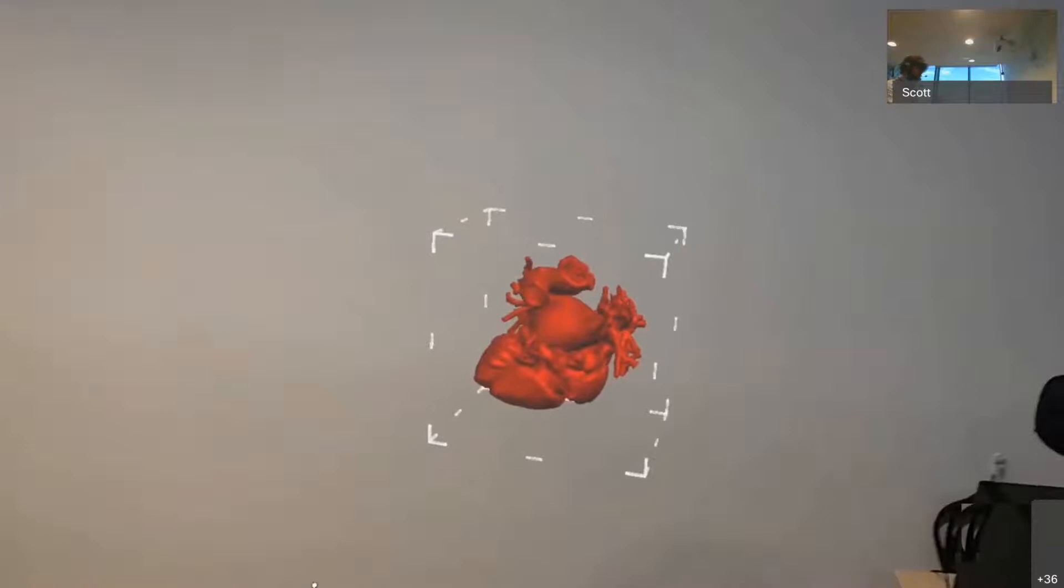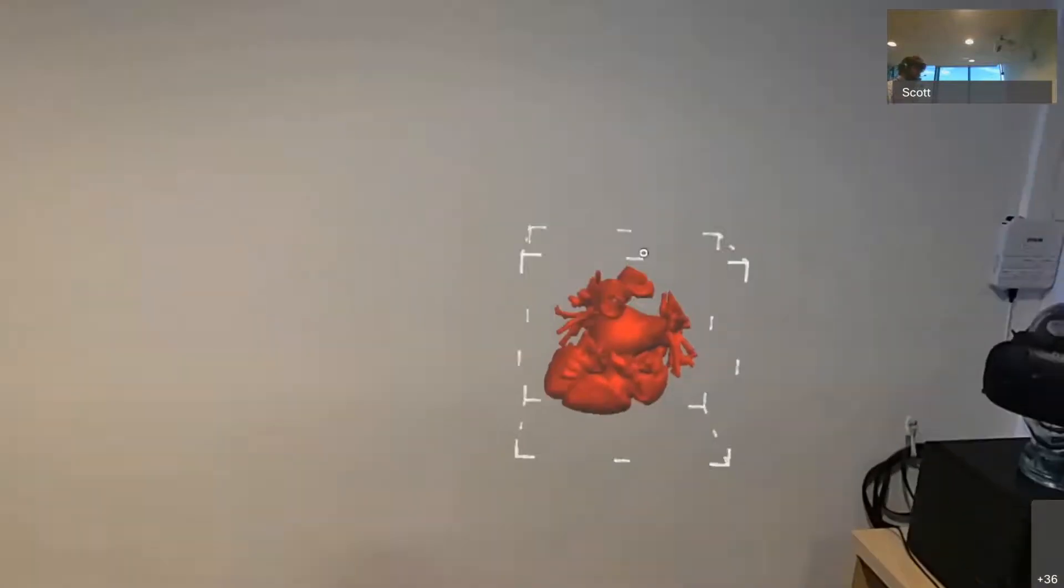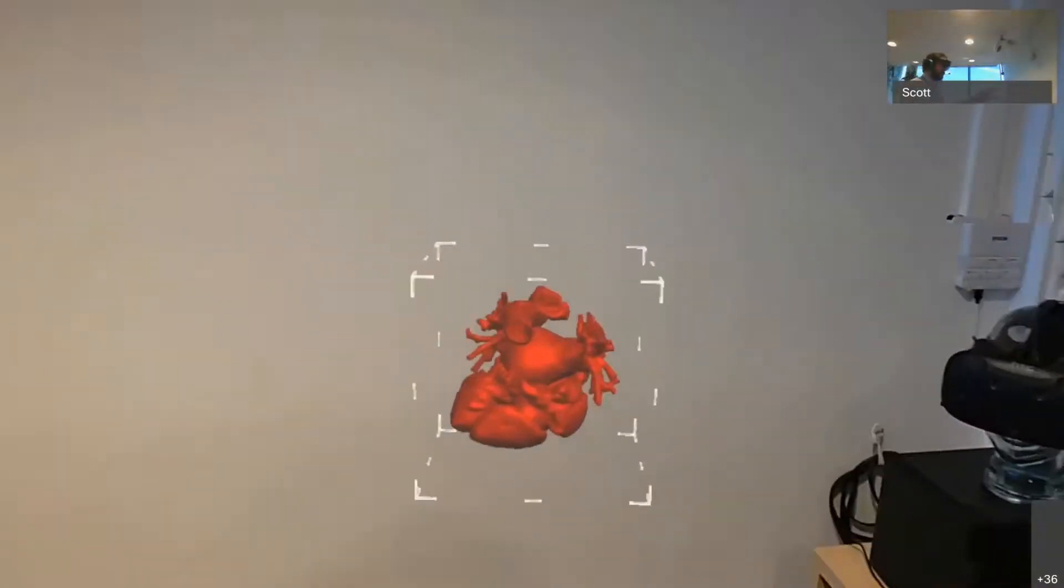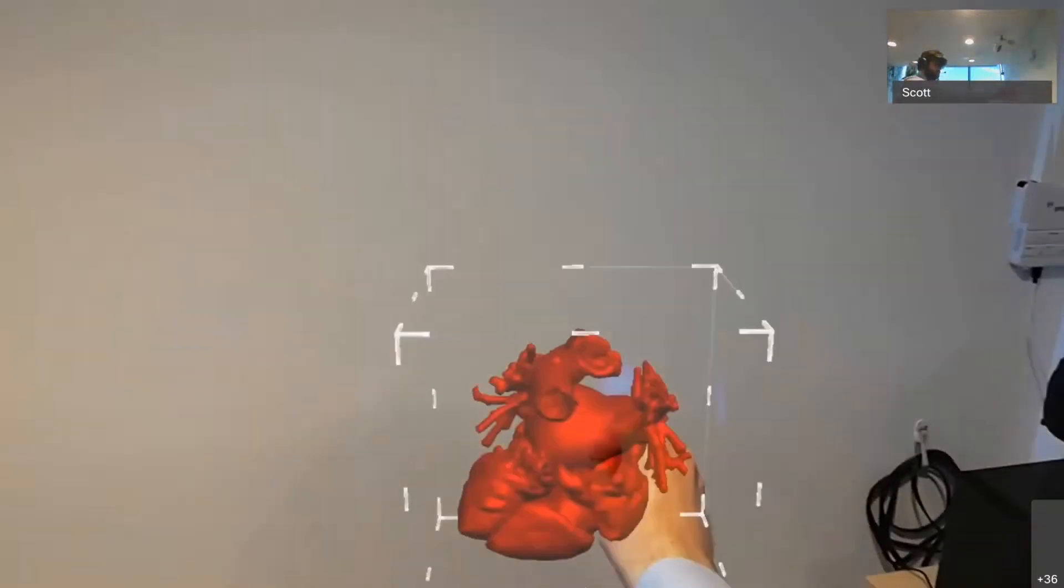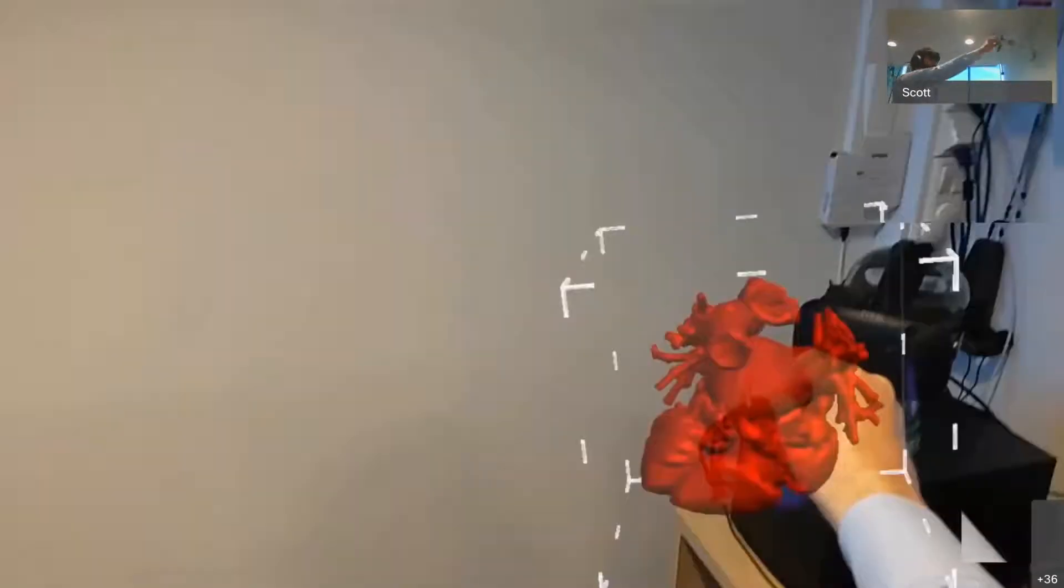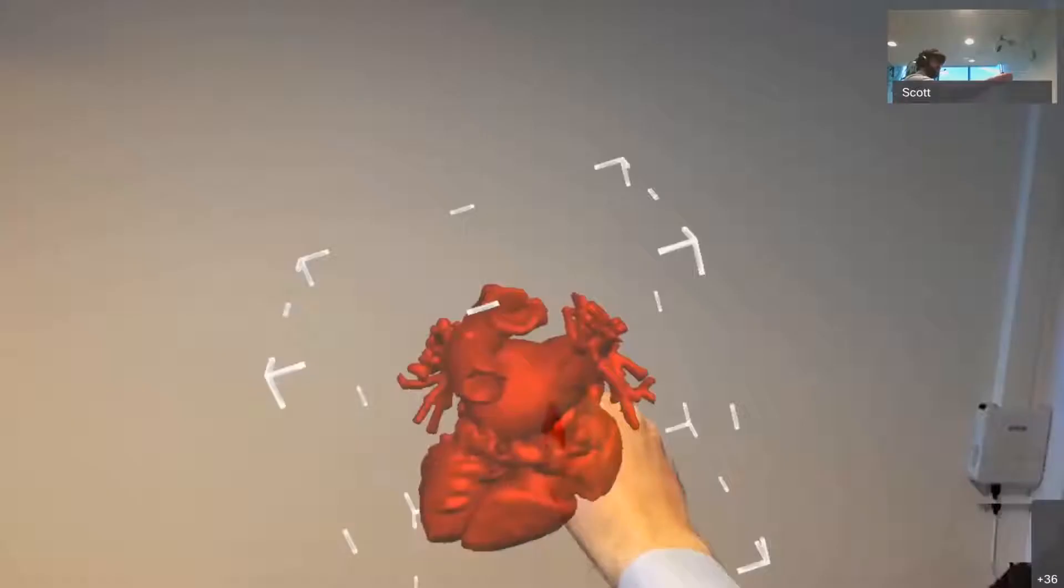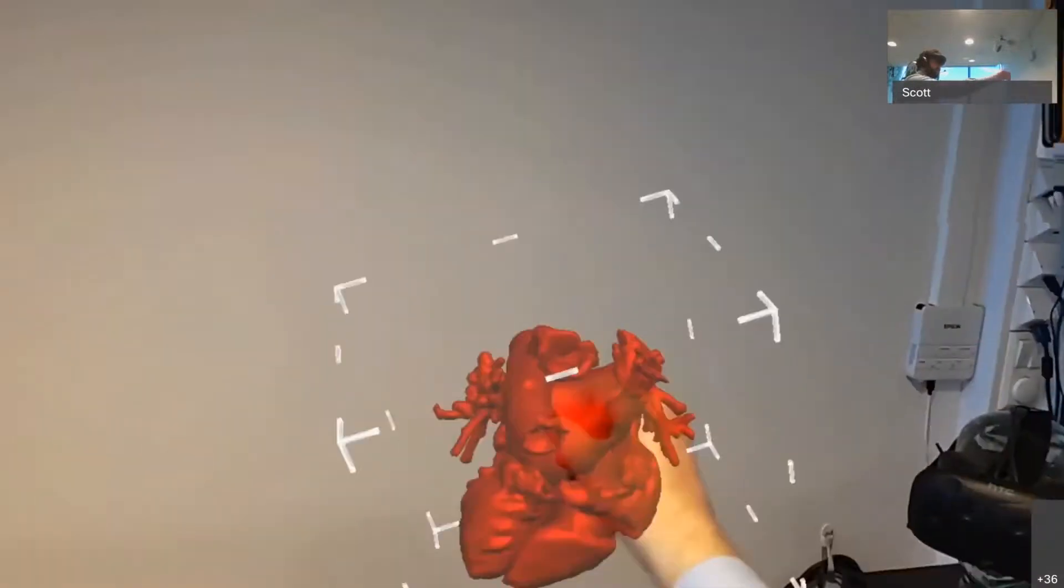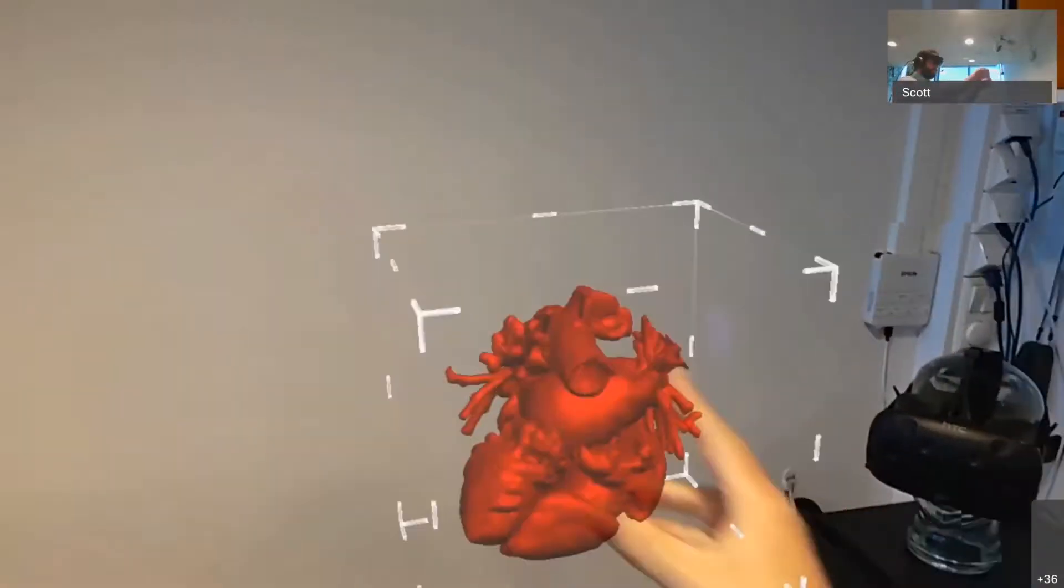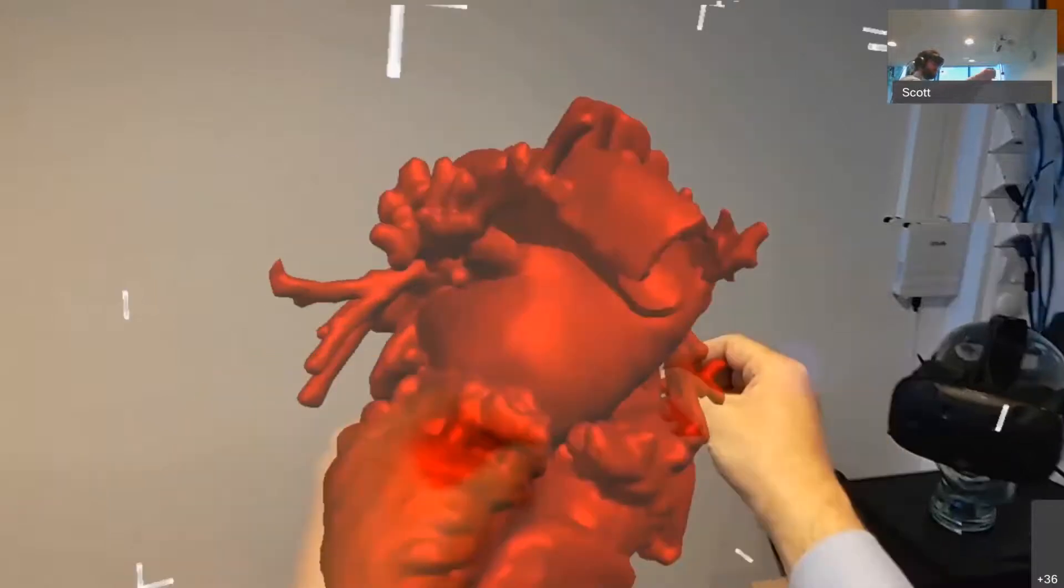And now this has put it in Manipulation mode. I've got a Manipulation box around the hologram of the heart, so I can reach out and grab it and move it around. I can rotate it. I can use two hands to resize it and also to rotate it.